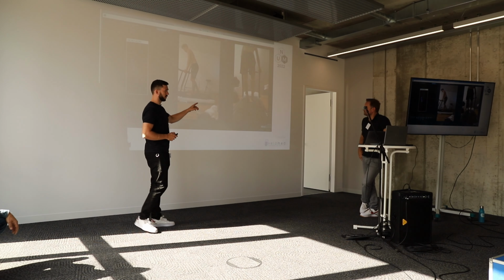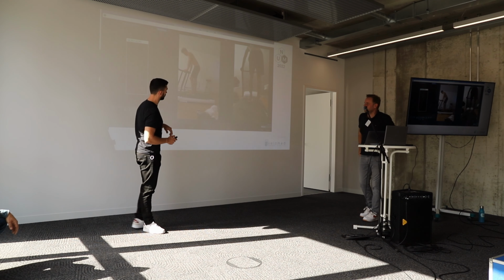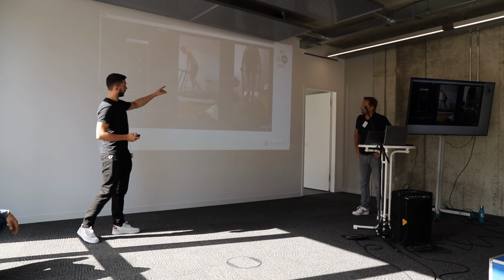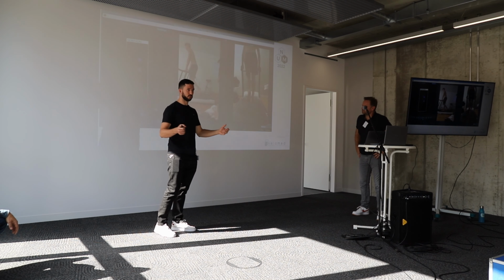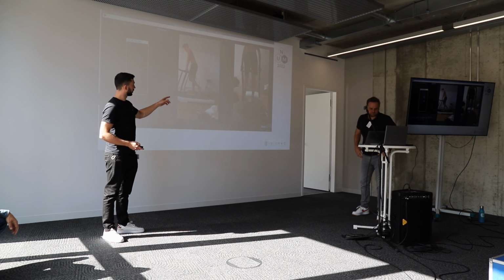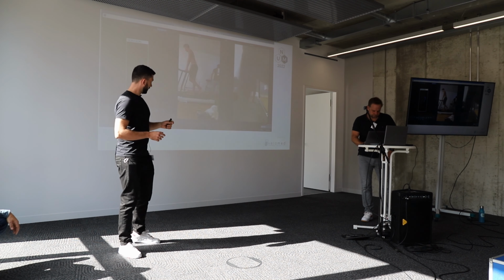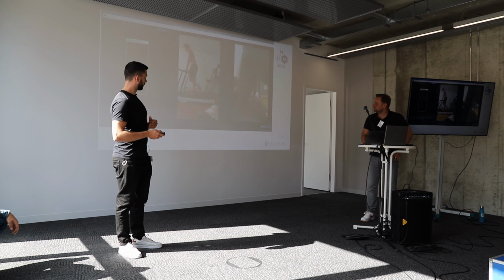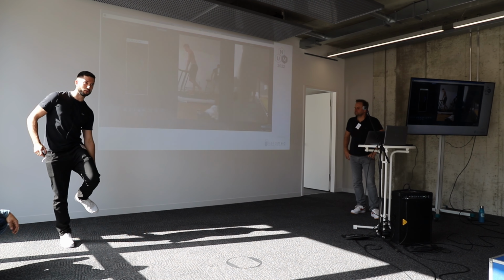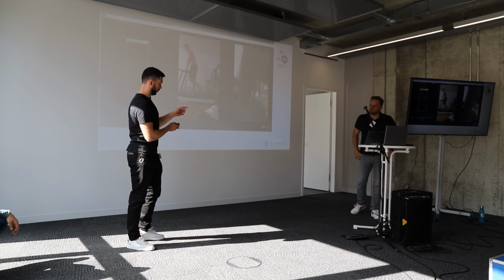And we saw him, was it 2 weeks after the injury? 4 weeks after. Okay, sorry. And did the whole test battery. You see as well that just for safety reasons, because the injury was not healed, he's holding himself. And this test was the one with the biggest outcome concerning the peroneus longus muscle. So just play it again.